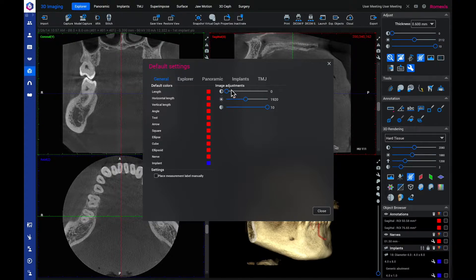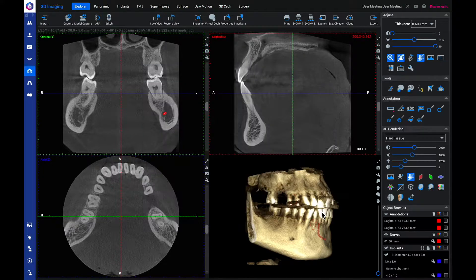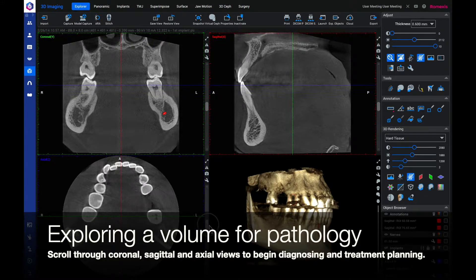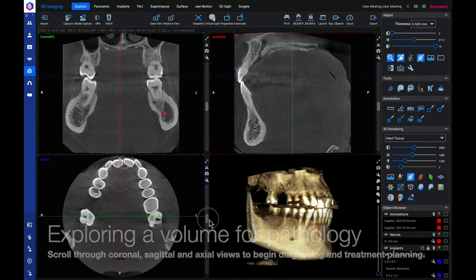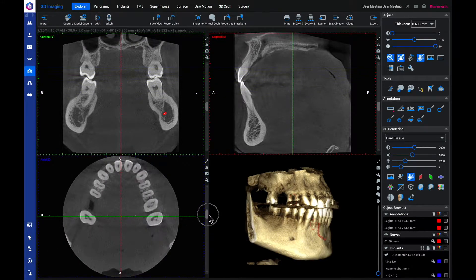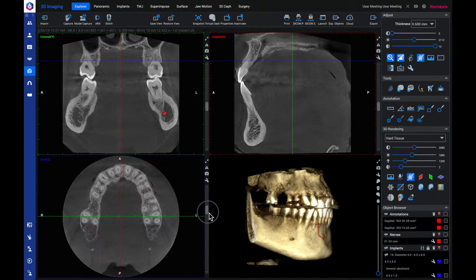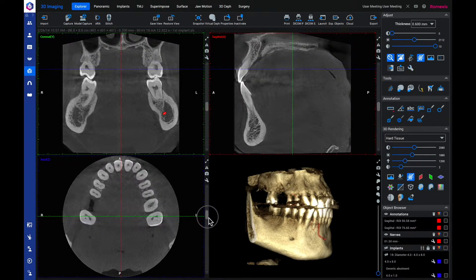These adjustments will be applied automatically to all new volumes. Scroll through the coronal, sagittal, and axial views to begin looking for pathology and treatment planning.